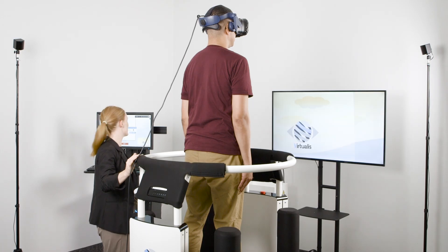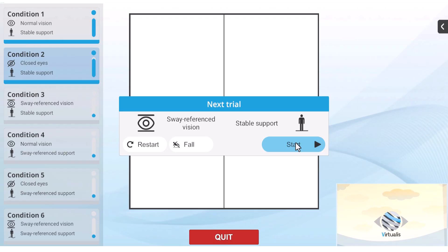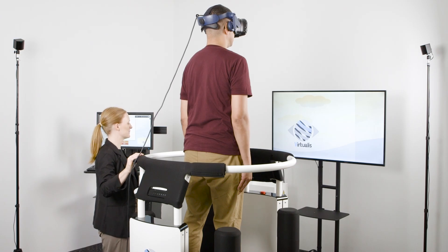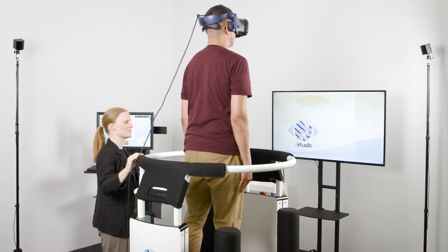Once condition two is completed, tell the patient to open their eyes and begin condition three. When the trial begins, the image in the headset will lock in place. Condition three includes a sway-referenced condition based on the patient's head position.